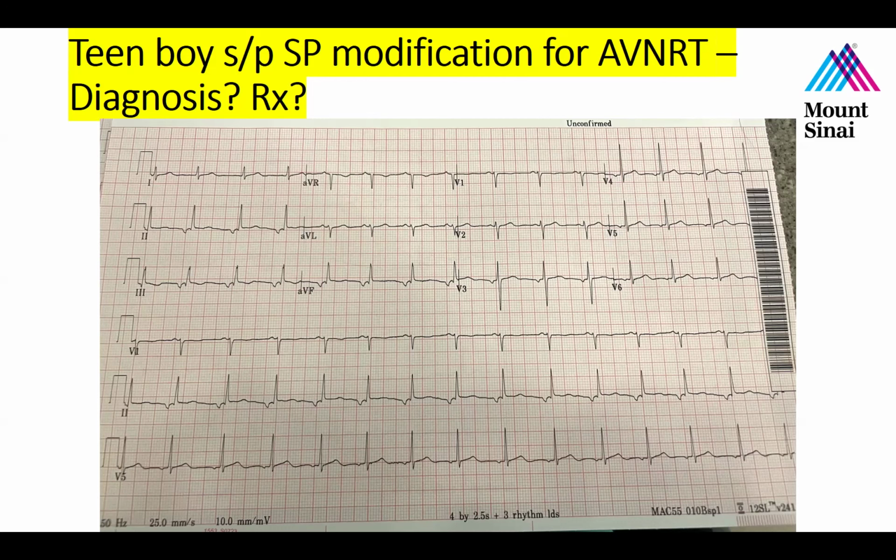So then, at that time, you probably see that Barry and, to a lesser degree, I use this catheter called a thermocool catheter, which irrigates the tip of the catheter and makes a deeper lesion. It was very hard to get a catheter like that. There was only one system in the entire New York Presbyterian at the time that had it. So I borrowed it from the adult cath lab, brought it over, burned it. It went away, and about 10 minutes into the recovery room, it came back.